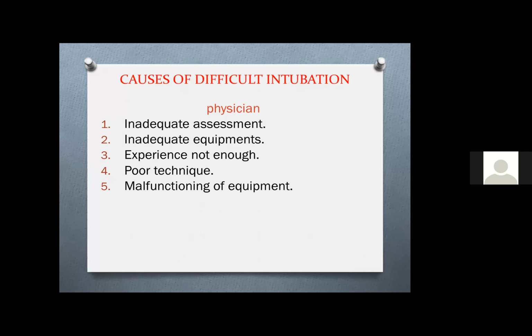Then you don't have a functioning suction. You ask a nurse, okay, I'm seeing the vocal cords, I have some secretions, give me the suction, and then it's not working.